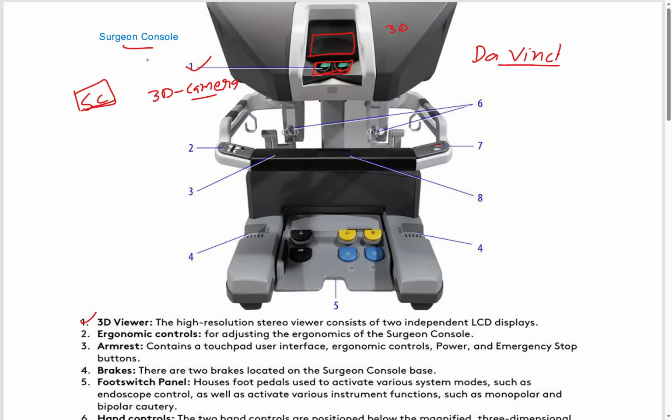That monitor may be HD 3D, or it may be 3D 4K. It depends on the company. Sometimes they will provide HD 3D, and sometimes they will provide 3D 4K.